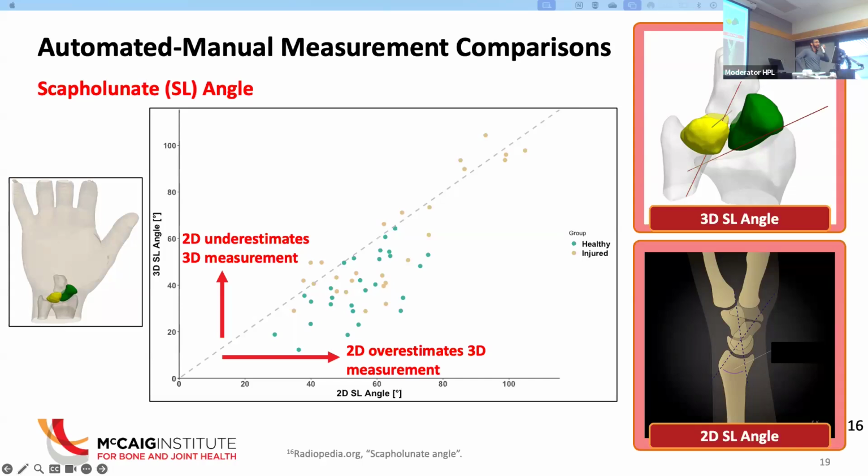My question was, do you think the carpal position changes are related, because CT maps would be the initial candidates for prognostic biomarkers of early degeneration or risk? There have been studies that have shown those contact area measurements can help identify signs of instability, even when a radiograph looks normal. Those have been pretty small case studies though. In terms of diagnostics, I think what's still most valuable is going to be the unloaded measurements. I think the load bearing measurements are going to be more valuable on the surgical planning side of things.